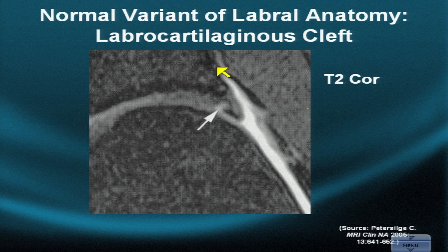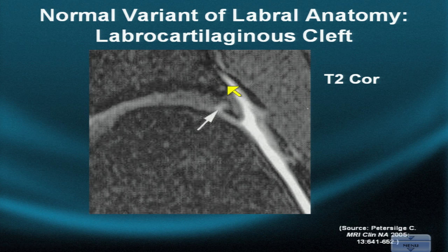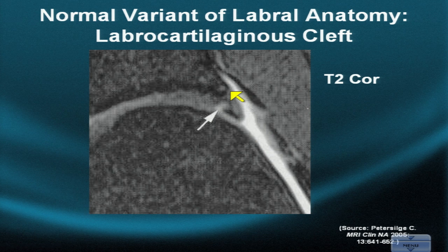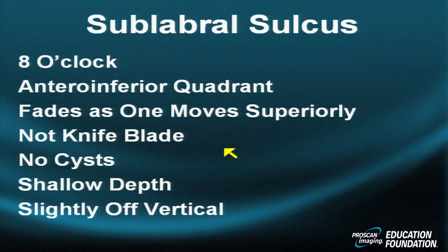The strong iliofemoral ligament reflects several millimeters above the junction between the fibrocartilage and the acetabulum. This reflection is only two to three millimeters in the young person, but gets a little deeper and longer in the adult as the iliofemoral ligament strips with advancing age.